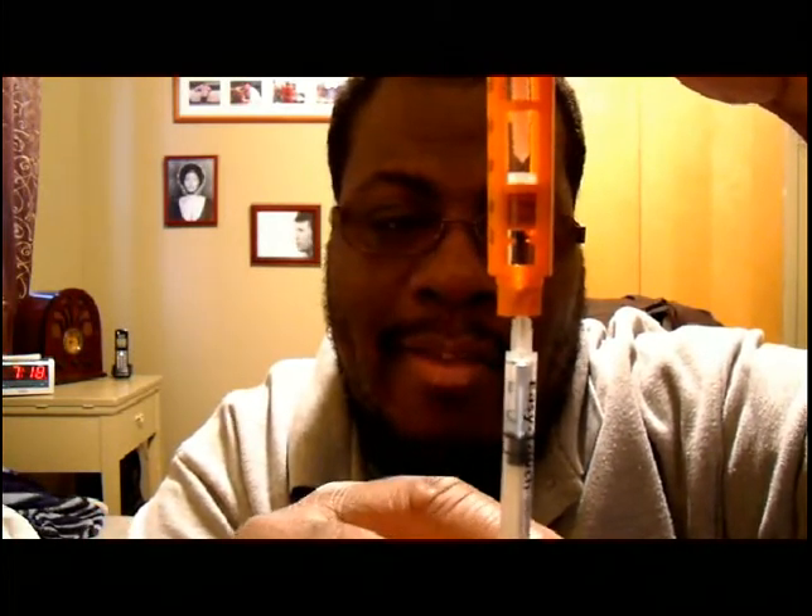I recommend that you take about a unit or two extra than the dose that you want to give yourself. The reason you would want to do that is so that you can just pop out the extra air.